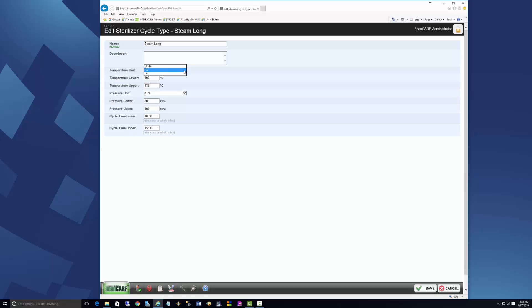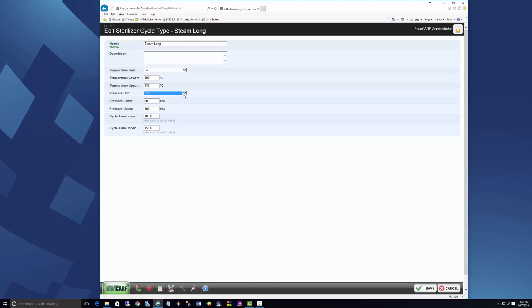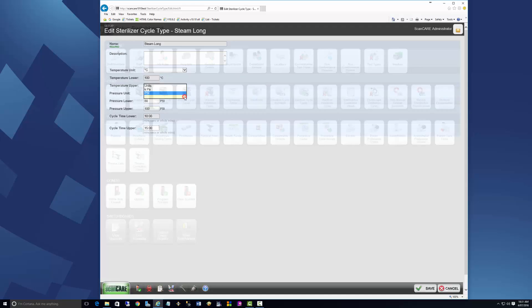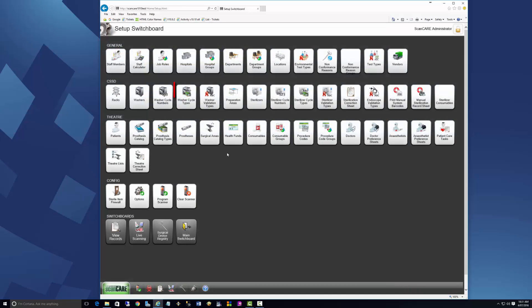On the edit screen, you can choose what unit of measurement you use for temperature and pressure. For temperature, you can select Celsius or Fahrenheit. For pressure, you can select between KPa, PSI, and bar.